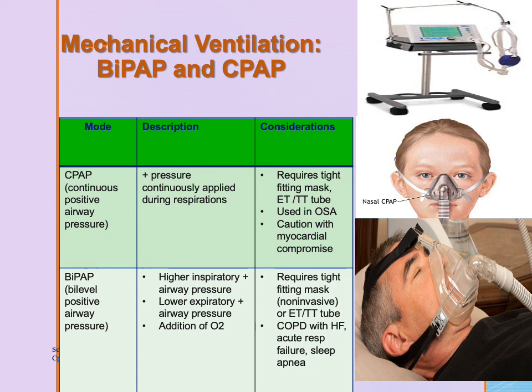Caution has to be used if the patient has any cardiovascular compromise, because there is a potential for the positive pressure to affect cardiac output. It causes a significant increase in intrathoracic pressure. CPAP might not be as comfortable for the patient depending on the amount of pressure that is applied by the CPAP machine, because the patient will be required to exhale over that pressure that is exerted during exhalation.